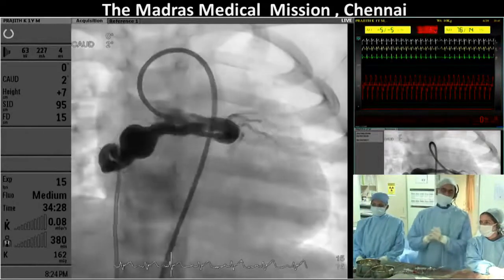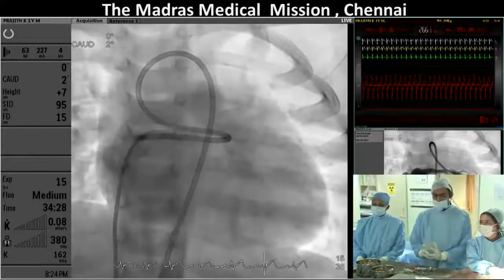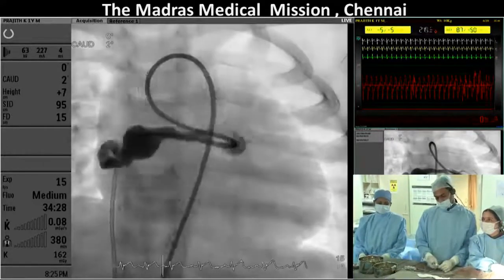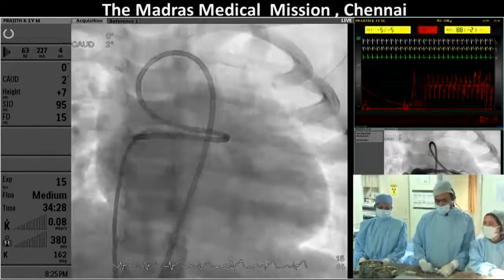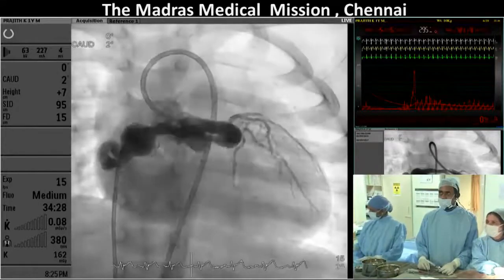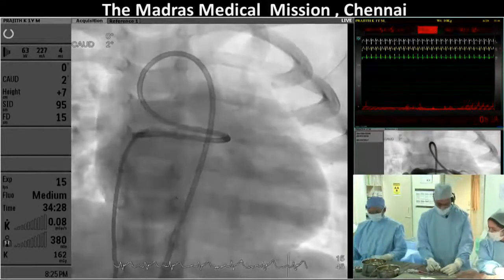I am not keen on closing the right atrial end at all and leaving behind a redundant sac. A sac will thrombose, and the thrombus will keep spreading. So if I have to close this fistula, I have to close it at the proximal end. Yeah, that's fine. Right now I've got one patient in whom we've done exactly that, but the distal end is still filling from the right atrium. So that aneurysmal portion has remained filling still, it hasn't blocked off. That's about a year later.